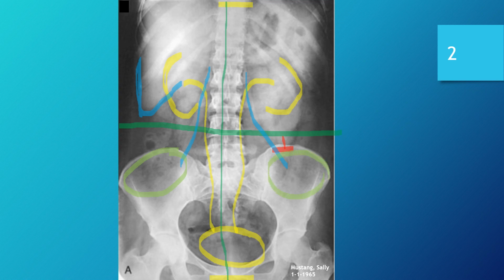And if you notice, it's also very apparent here in the area of the coccyx in the lower part of the sacrum. That bowel gas obscures that quite a bit, and so if there were some lower abdomen pathology that was of some concern, this could potentially obscure it.